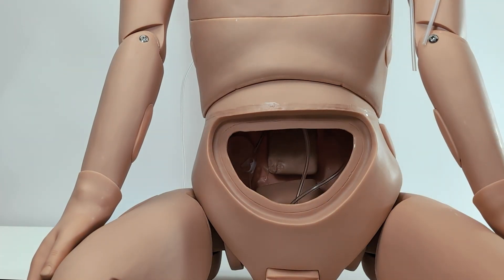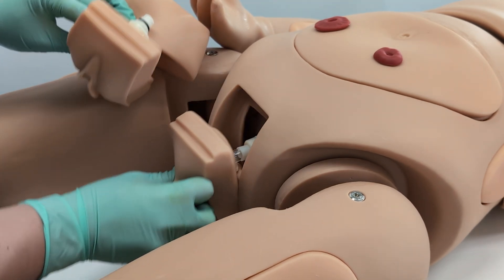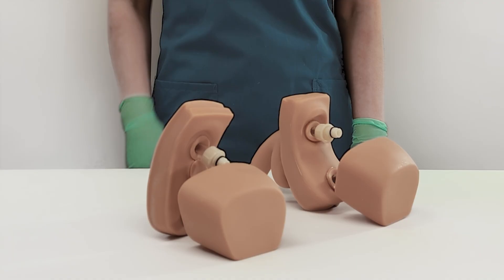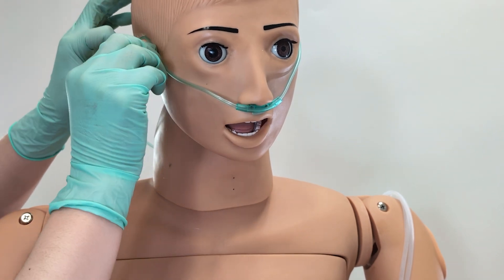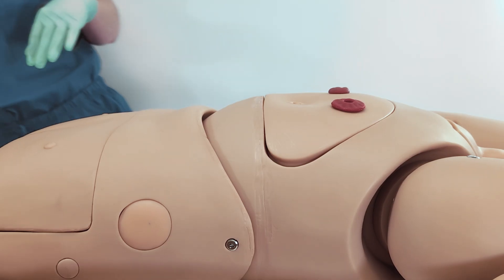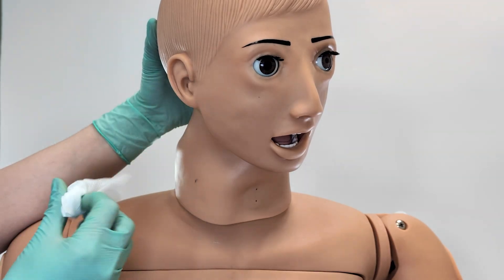For catheterization procedures, this model features removable male and female genitalia, with functional bladders and urethral openings, as well as a functional rectum for the practice of enema administration. The model also offers a variety of post-operative hygiene procedures, including ostomy care, tracheostomy care, eye, and ear cleaning.